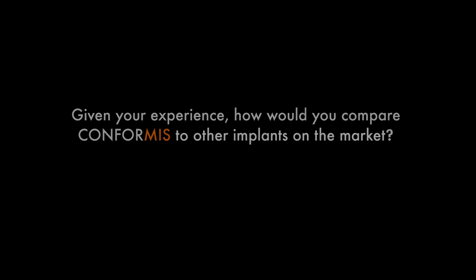Conformis represents a massive leap forward. It's a sea change in the way that we approach knee replacements. It's a revolutionary improvement. It's leaps and bounds above any other knee replacement that's out there. And my patients, the patients that I see in my practice, they're very high demand and they expect the best. And the Conformis knee is the best. It is significantly better than any other prosthesis I've ever encountered. And so I have moved over to the Conformis knee as I want to provide the best possible care for my patients, and Conformis allows me to do that.